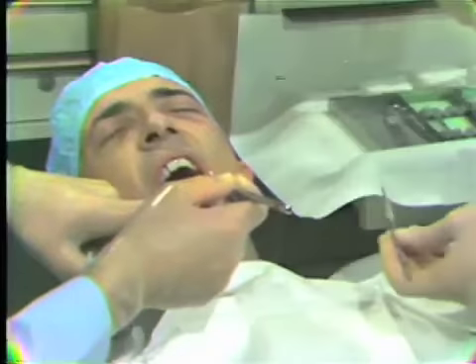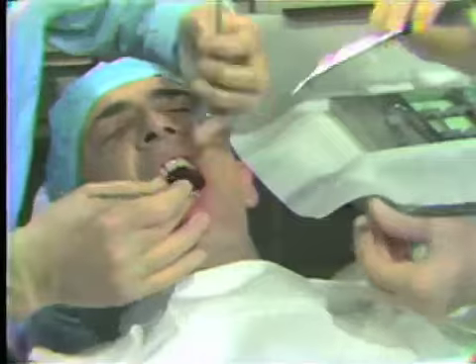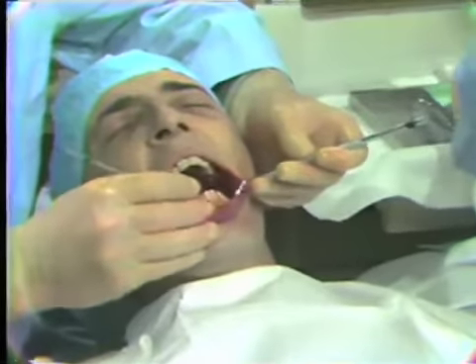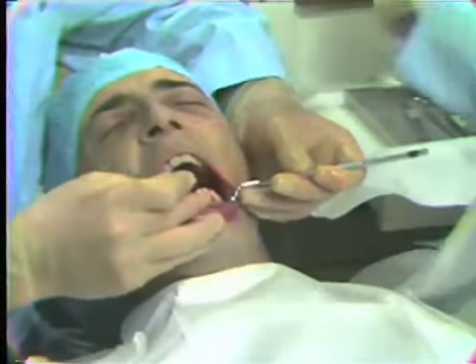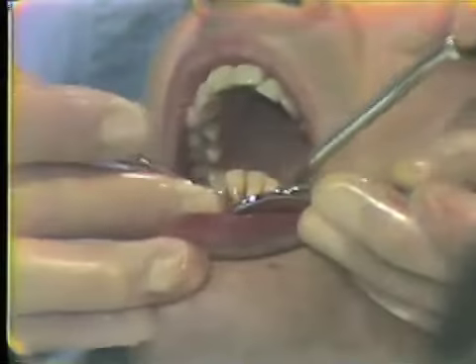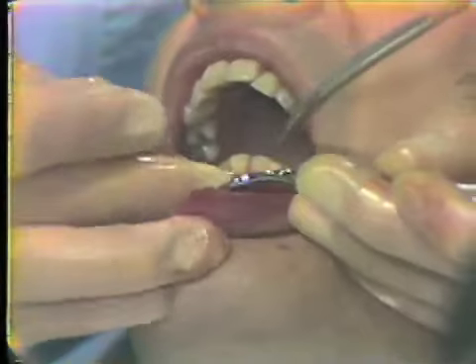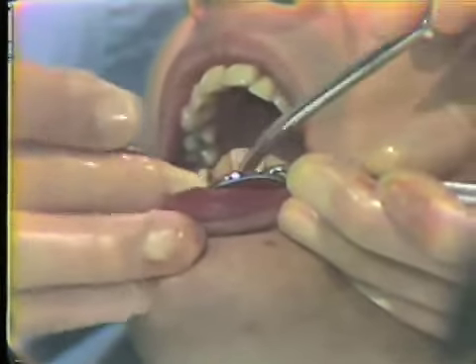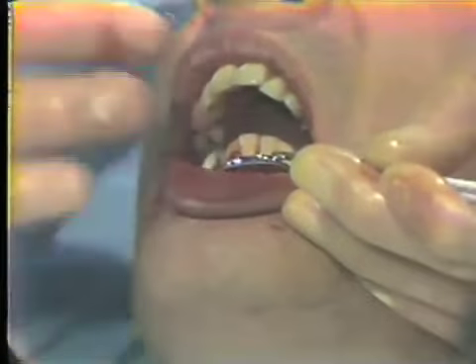Now the curette again, please. We many times will be able to use the mirror for retraction or the aspirator tip occasionally for retraction in cleaning around the surgical site. The end of the aspirator tip many times can be placed in the area that is helpful in reflecting the flap as we go around the necks of the teeth to curette in the area where the chronic granulation tissue has built up in the area of surgery.